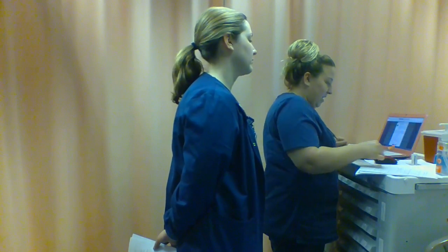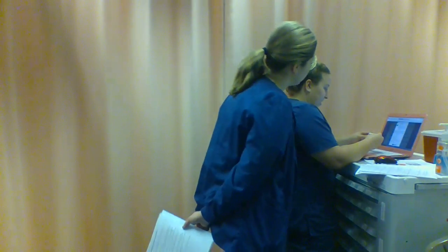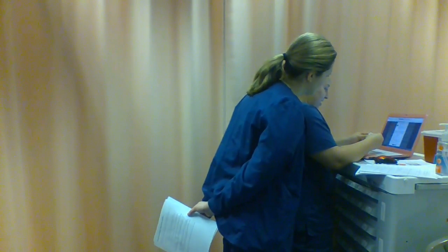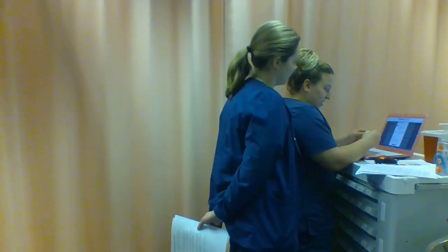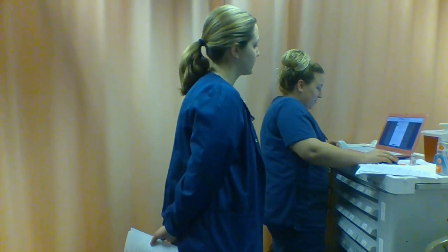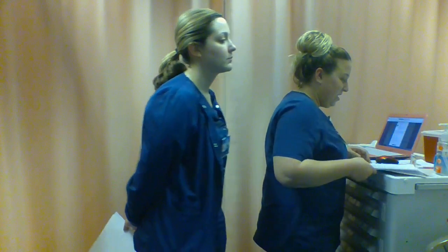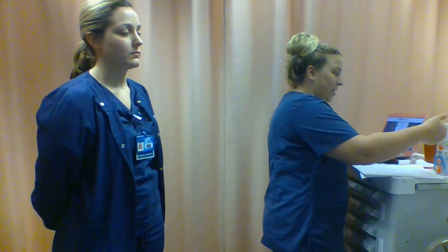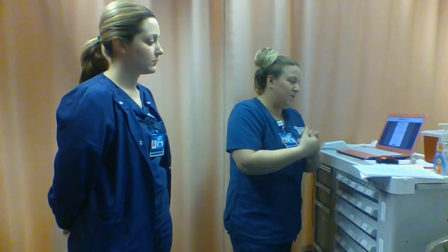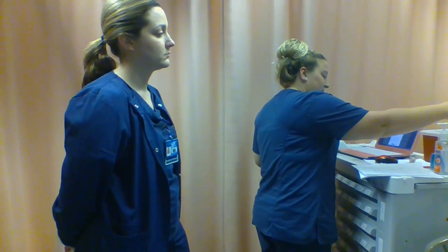Okay. And then, so again, I want to just make sure we have the right medication, right dose, right route. Expiration date is February of 2018. Okay. So now we're going to actually go ahead and administer the medication. So I'm going to go ahead and wash my hands. My gloves.